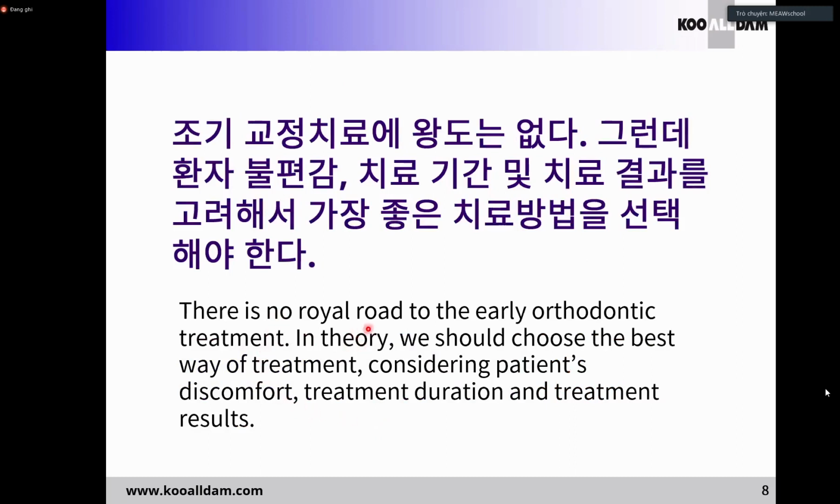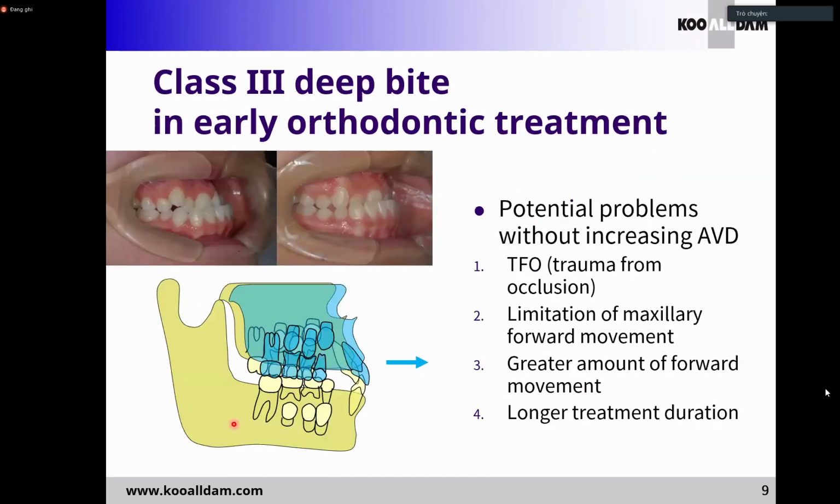There is no royal road to early orthodontic treatment. In theory, we should choose the best way of treatment, considering patient discomfort, treatment duration, and treatment results. So this time you should remember this class 3 deep bite.